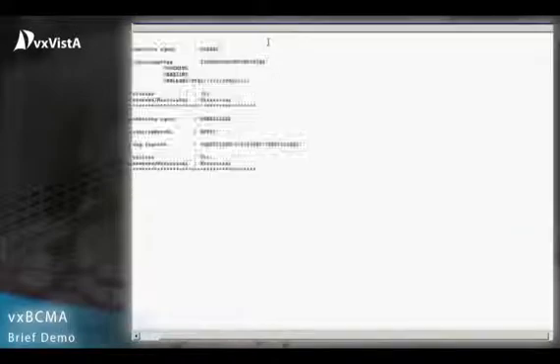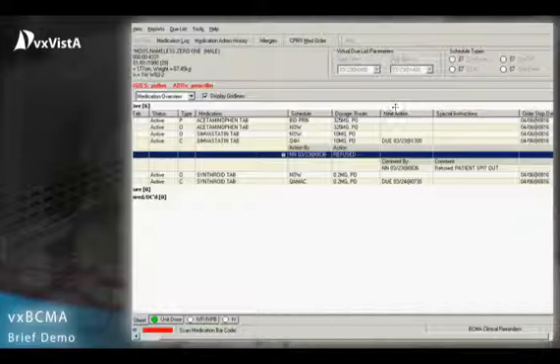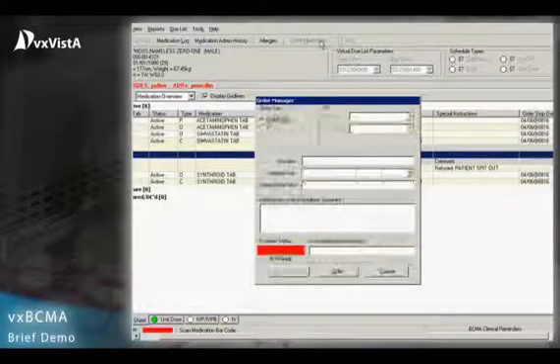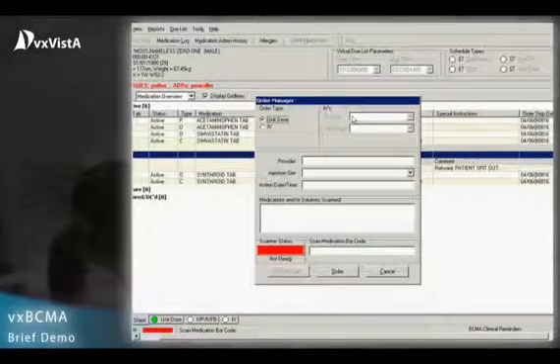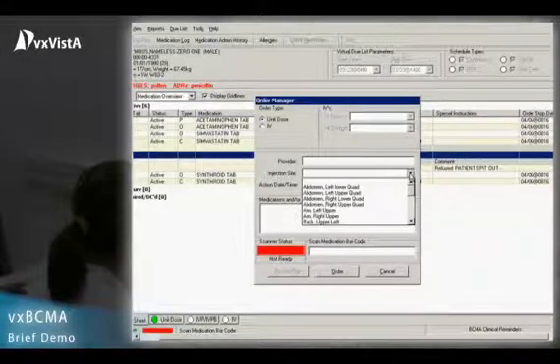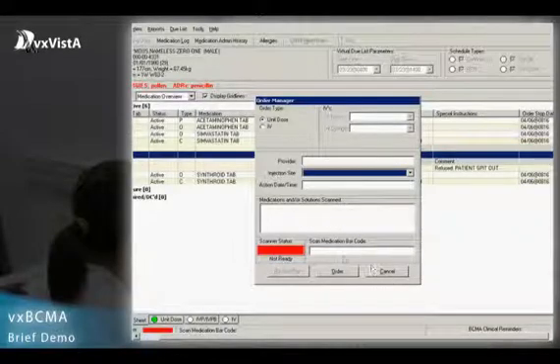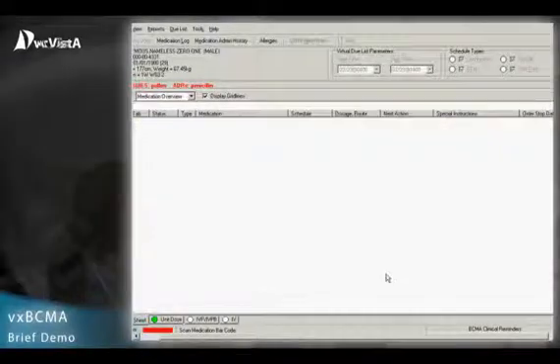VXBCMA generates reports and the data entered through VXBCMA is viewable within VXCPRS reports tab as well. Using VXBCMA helps foster strong collaboration between pharmacy and nursing staff.